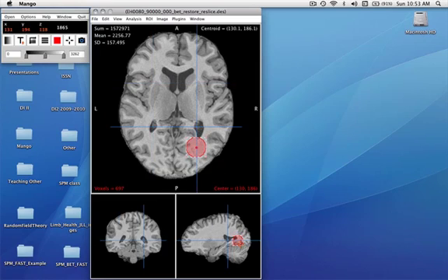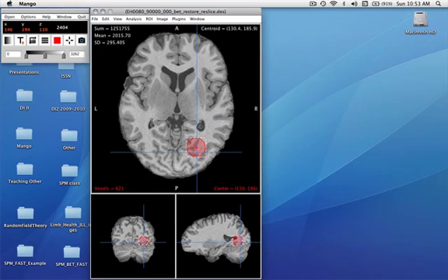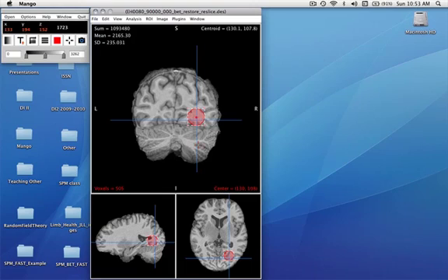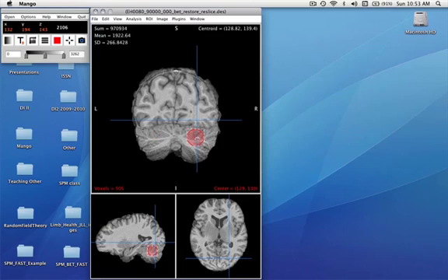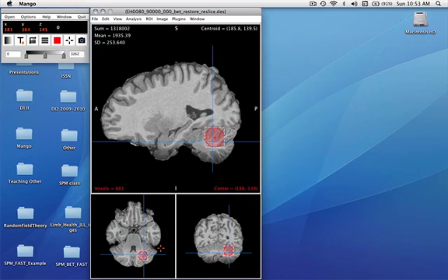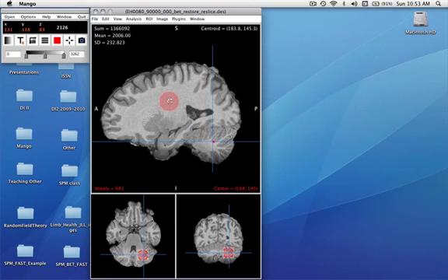We can also change the view and move it in different views. Mango's region of interest can be edited and moved in any of the views. So let's move him up here.